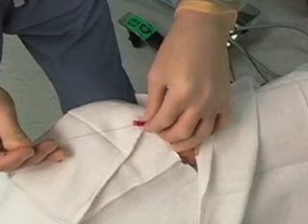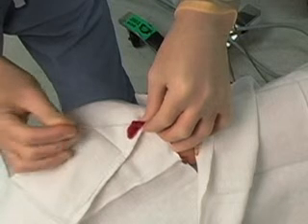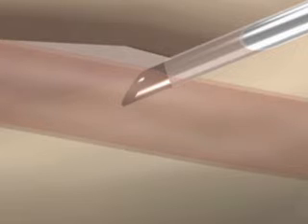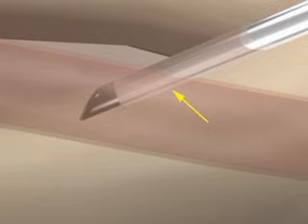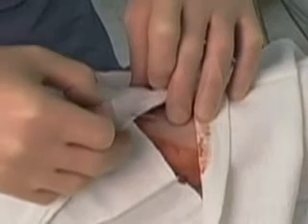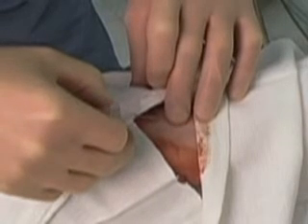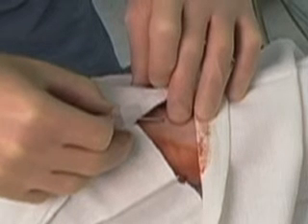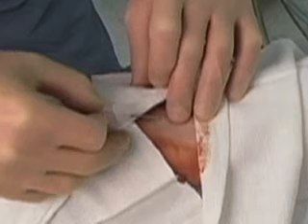Occasionally, free flow of blood is observed, but the catheter will not pass easily. In the animation, you can see how the tip of the needle might be within the vessel, while the catheter remains outside. By advancing the needle slightly farther after the initial flash of blood, the catheter can enter the artery, allowing for successful cannulation. In some instances, the catheter may get hung up on the skin, making it hard to advance. The risk of this can be minimized at the start of the procedure by making a skin nick using either an 11-blade scalpel or a larger bore needle.